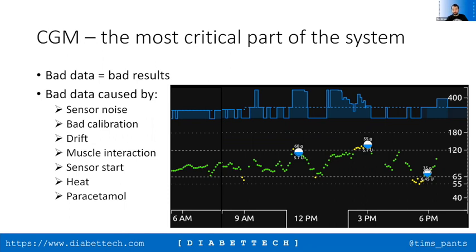It's also why in using the Libre, because of the way the data can be a bit variable, there are concerns about leaving SMB on all the time.